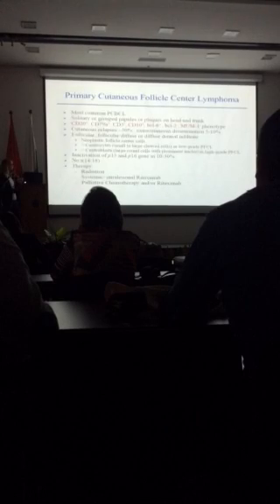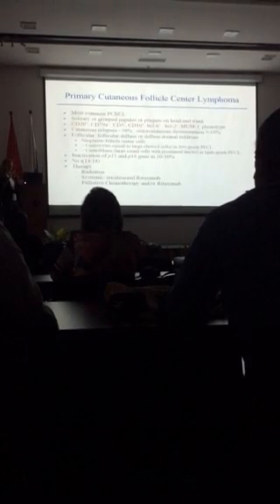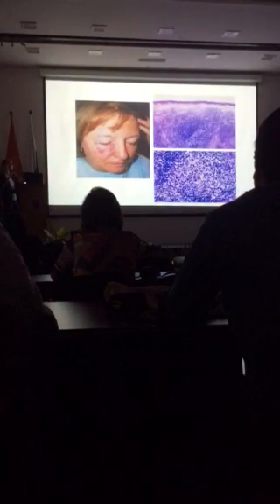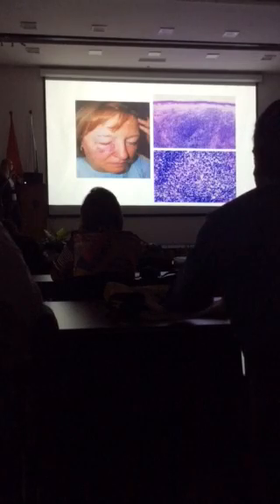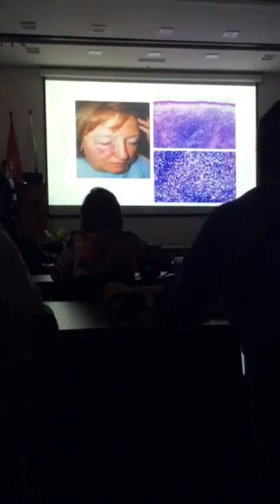Again, as I said, BCL2 is negative. That basically means there's no translocation 14;18. This is a patient of mine who presented with a facial lesion. You can see the whole cheek is involved here and here. You predominantly find a dense infiltrate.